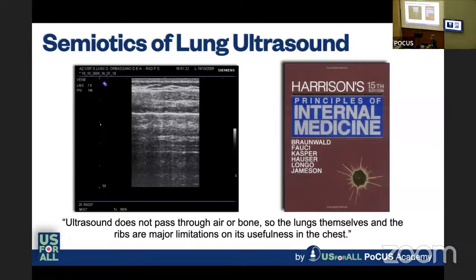And if you observe more carefully this image is nothing more than the exact reflection of the chest wall below the pleural line. So just a mirror effect that is due to the air inside the lung. And this reflection of the chest wall happens many times.